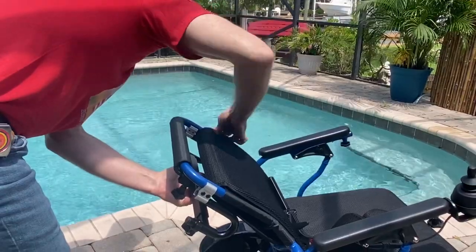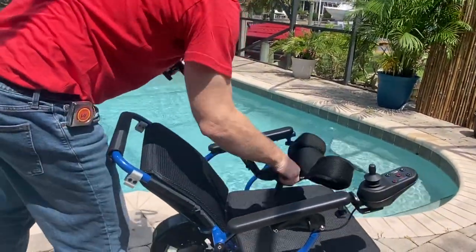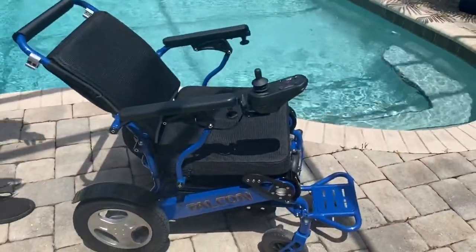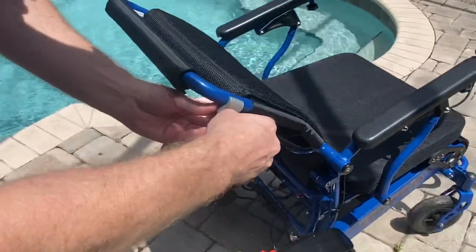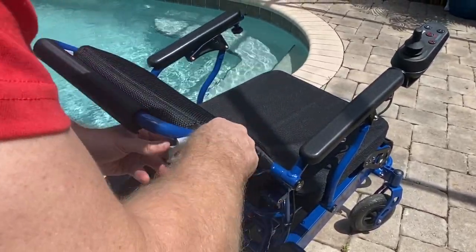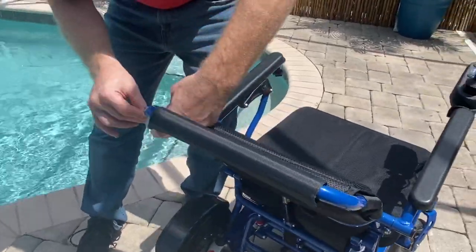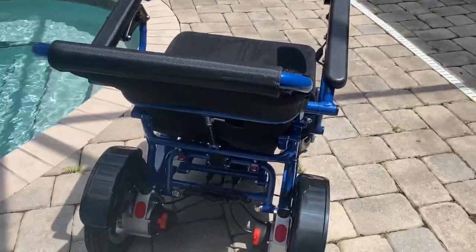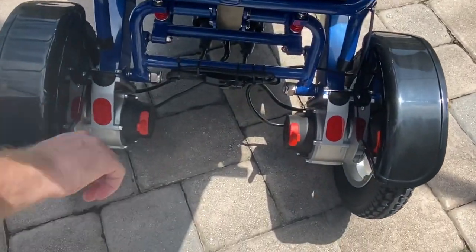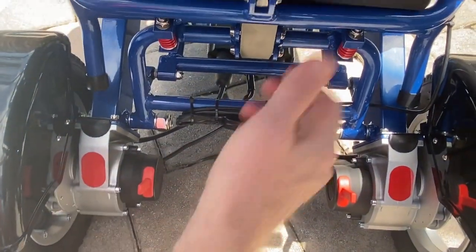People want to know about the ability of the motors — we have two 250-watt motors on this chair. Let's get these brackets out of the way and take a look at the back of the chair to understand what is under the hood, so to speak. What we're looking at right now are the actual motors: two 250-watt motors.